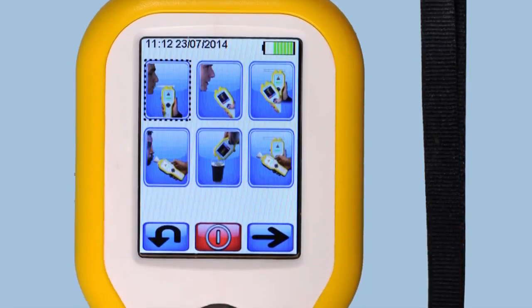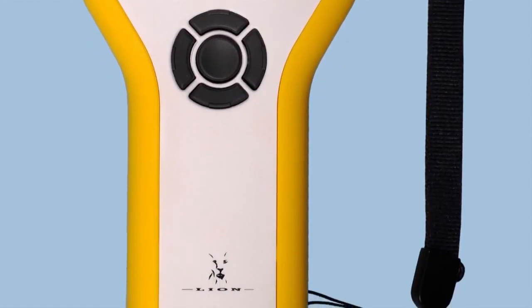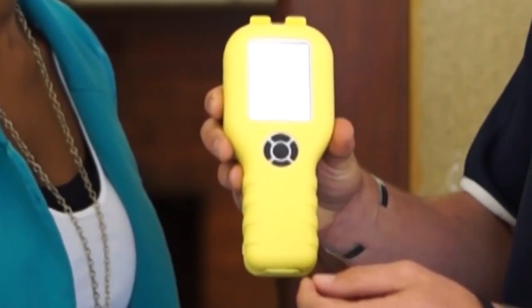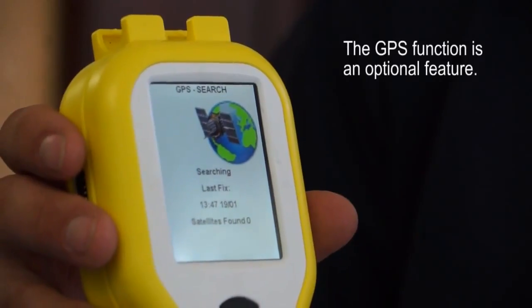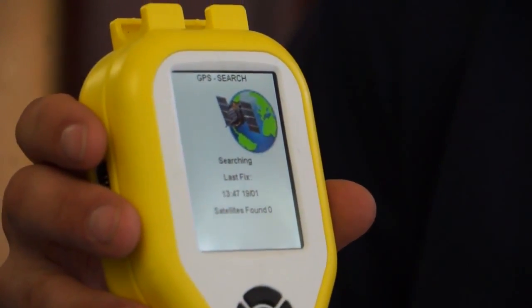This is our new Lion Alchemeter 600 Touch. To switch it on, we'll just push the on button in the middle here and then let it go. The GPS function will then search for where the instrument is and it will log the GPS coordinates of every test that gets done.